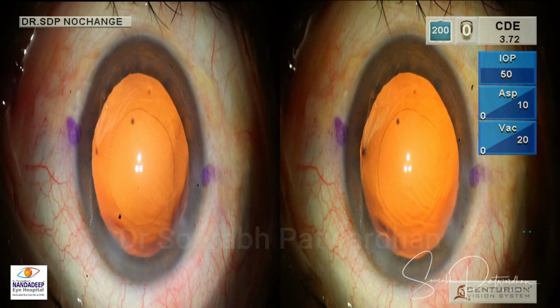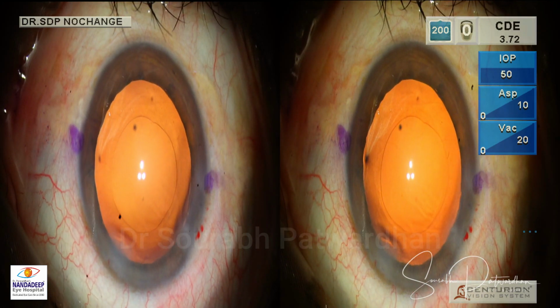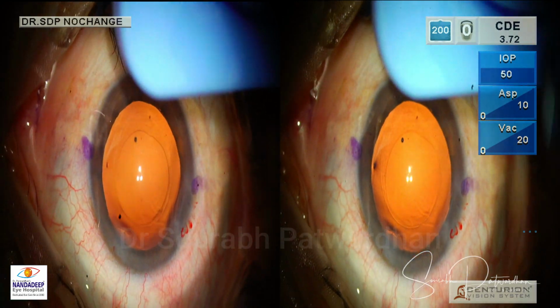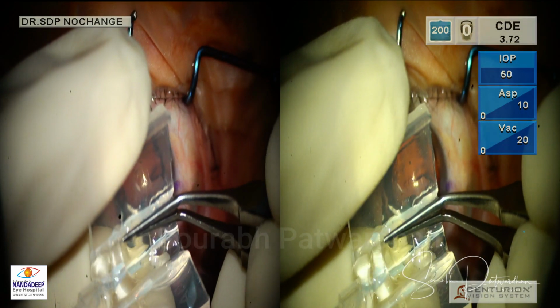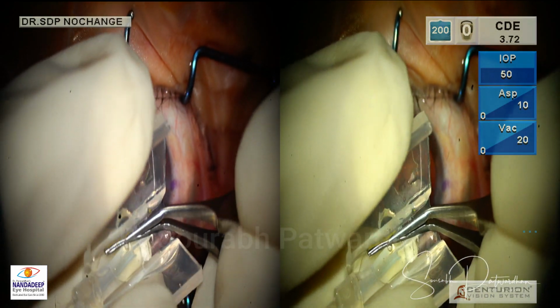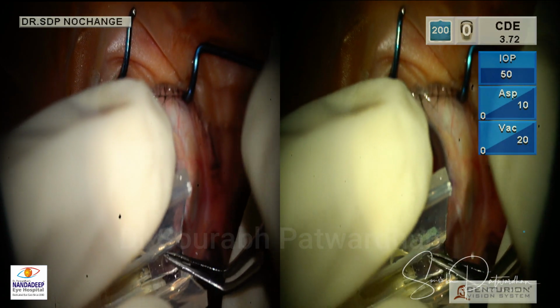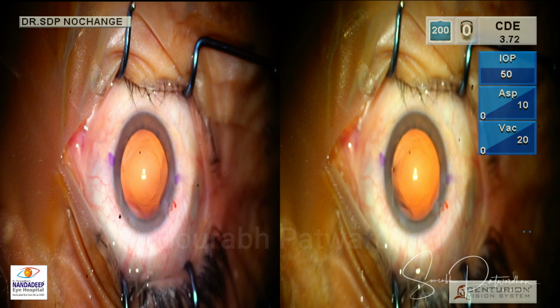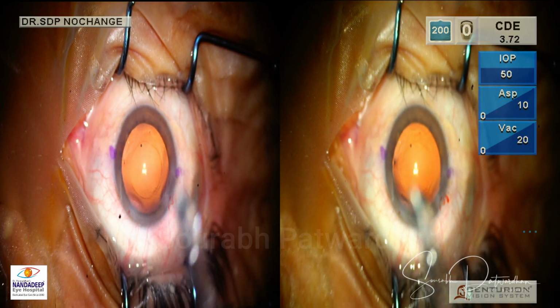Whenever you are using any cannula, you have to hold the hub. That is very important. Otherwise, you may have flying cannulas, and that is not good around the eye. Of course, Luer lock is the best. So I think that's what Alcon has modified in the newer Centurion and Legion, that the irrigation line has a Luer lock. So sometimes during phaco, the irrigation just comes off, which is risky. If you have Luer lock, it is definitely much better.